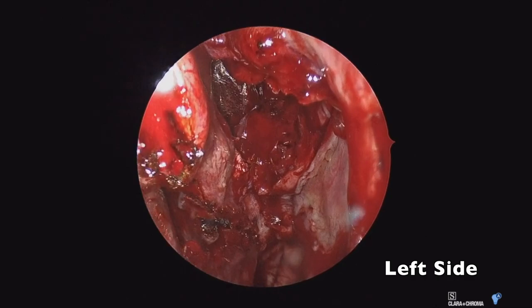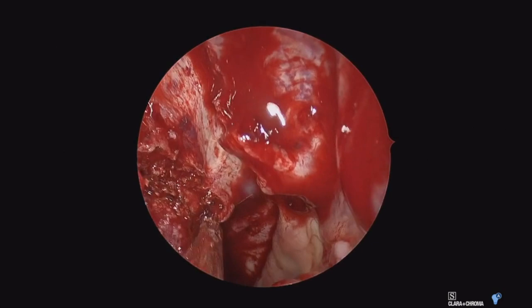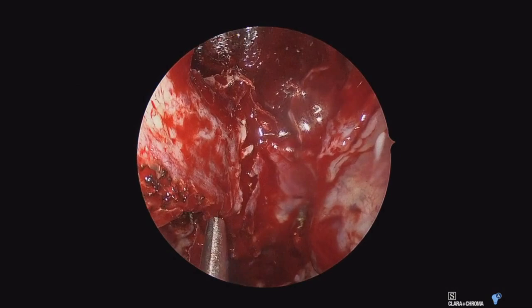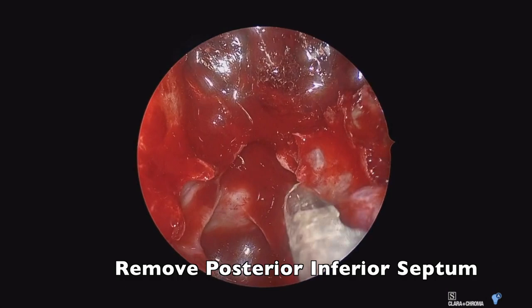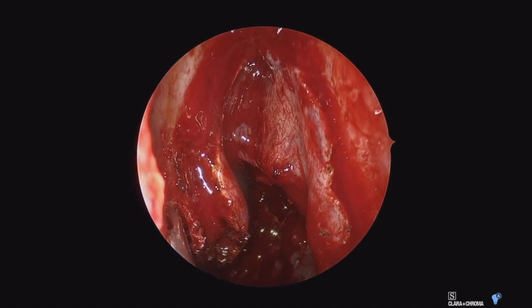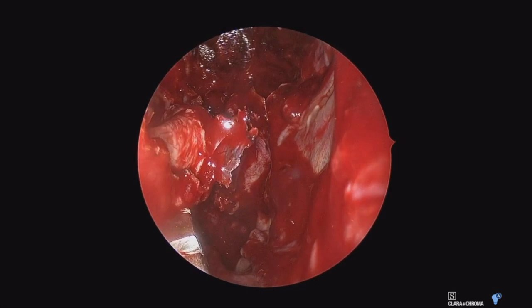Here we are back on the left side, seeing the left nasopharynx with our lower septectomy defect, and looking to the contralateral side as well. We'll make some incisions to fully remove all of the mucosa in this area and sample margins as we work through. Here we are completing our septectomy, bringing that bony posterior septum off the rostrum of the sphenoid and removing it in its entirety, then resecting the more anterior septum as well.